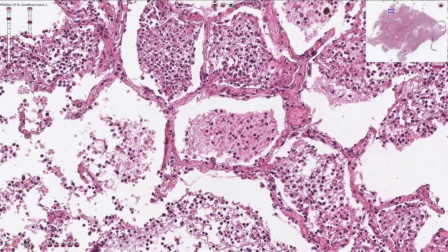Inside the inter-alveolar septi we can see capillaries filled with erythrocytes and lined by endothelial cells, as here for example. Oxygen from the air gets to the alveoli and then crosses this layer to get into the erythrocytes, and from there it can reach multiple tissues all over the body.